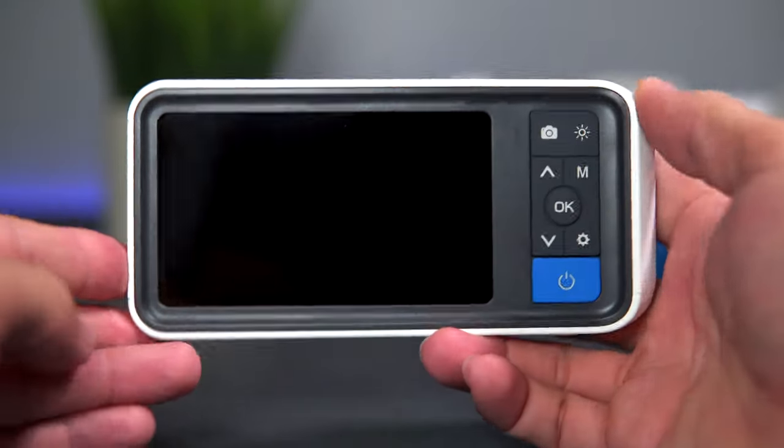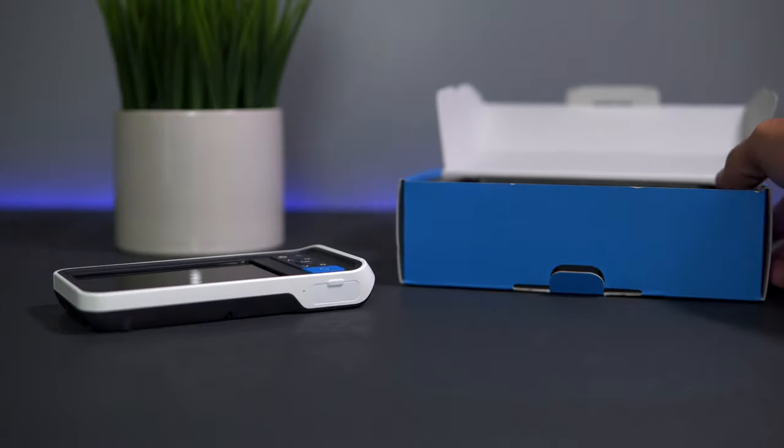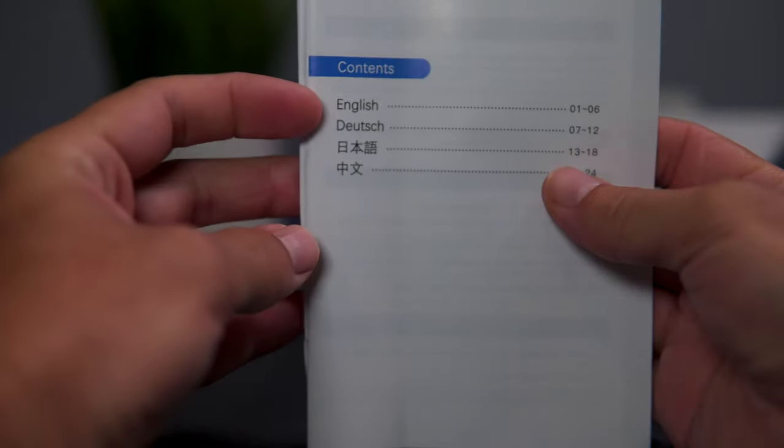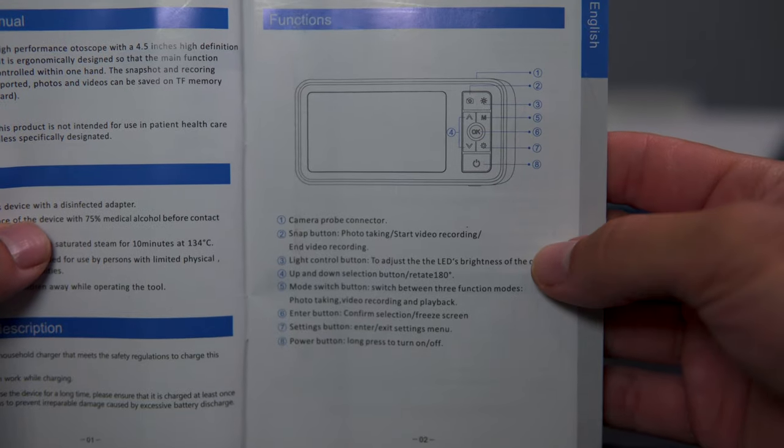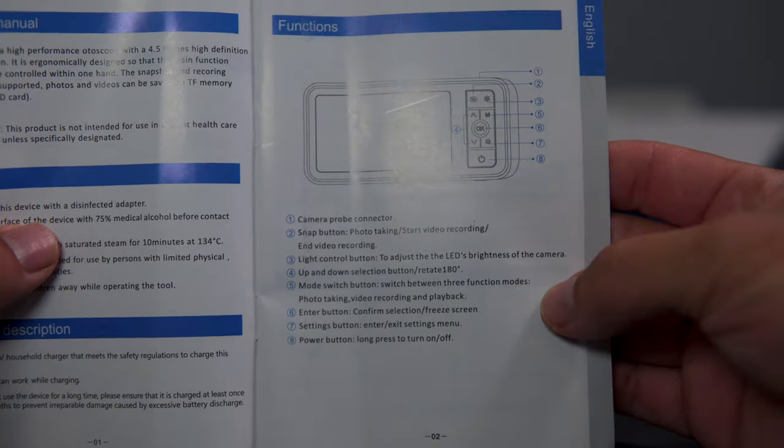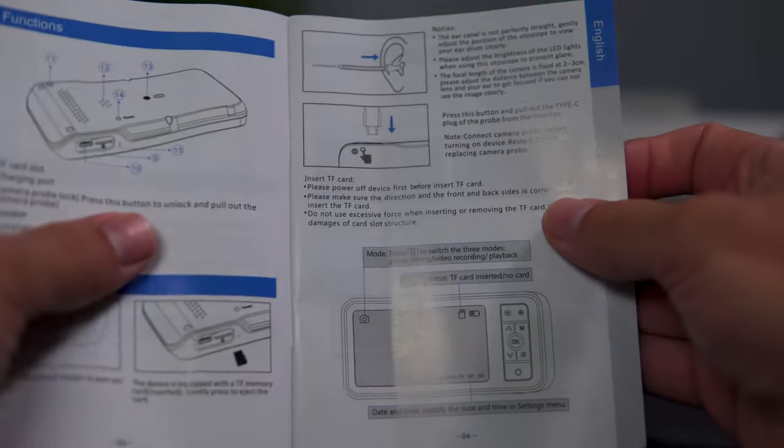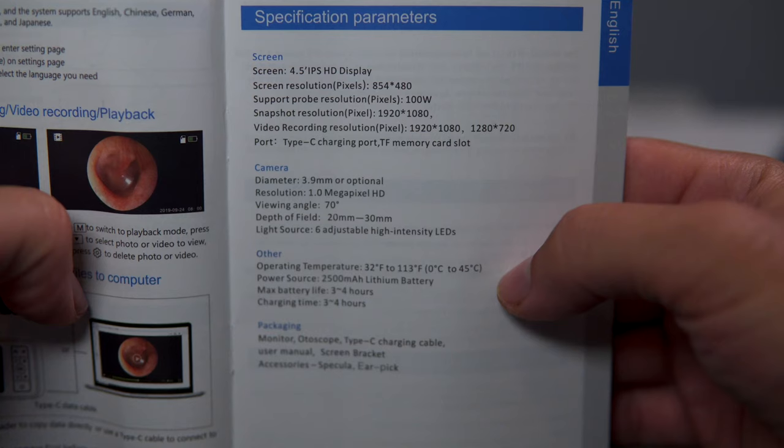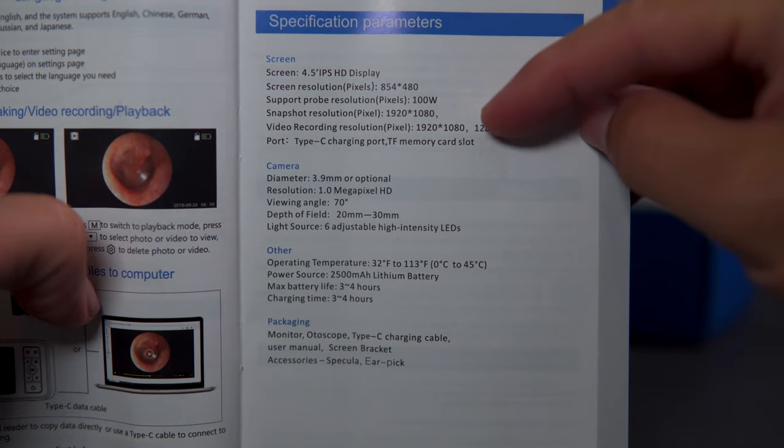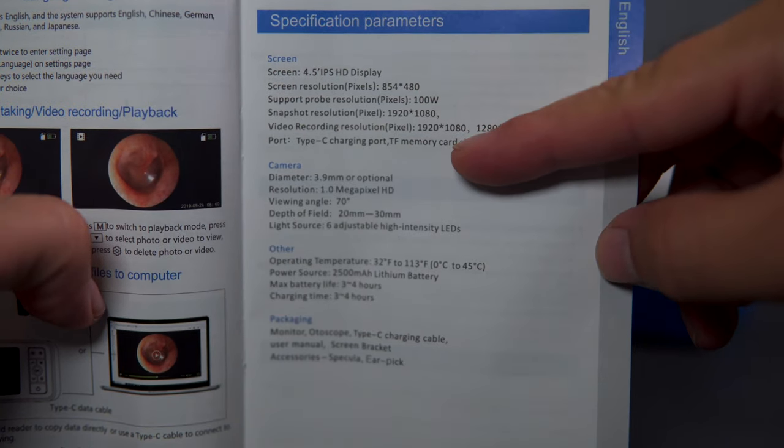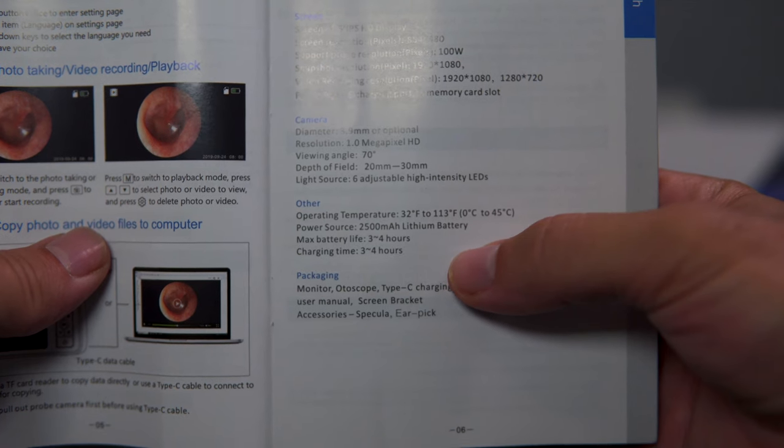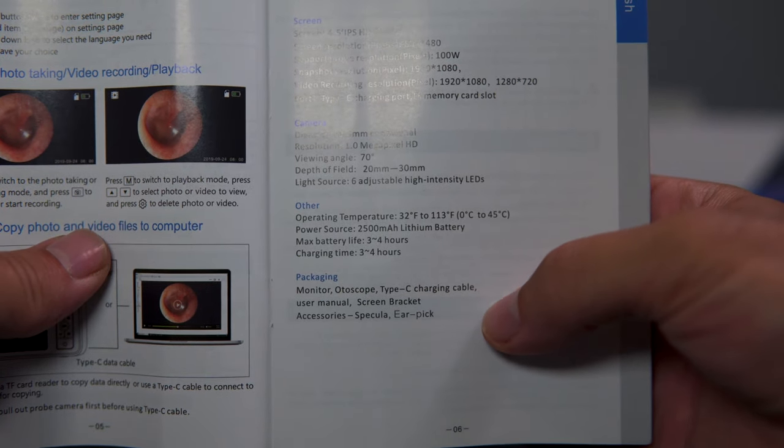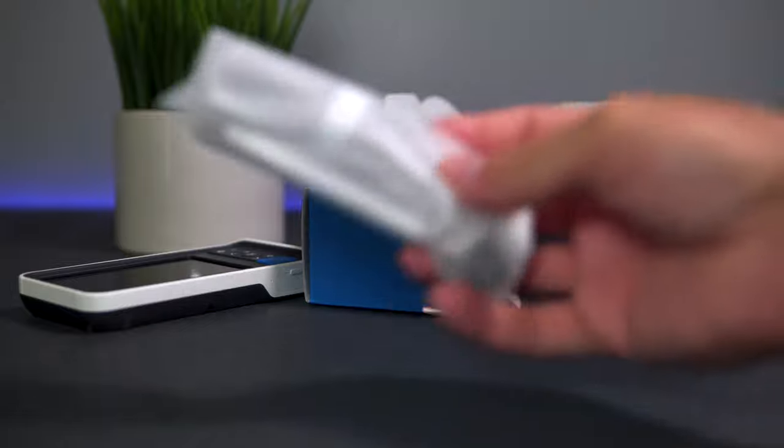Let's see what else is in the box. We have a user manual with four languages. It shows us a breakdown of what all the controls do, instructions on how to use the device, and all the specs. Four and a half inch screen, photo and video resolution is 1080. Battery life is about three to four hours, and charging time is about the same.